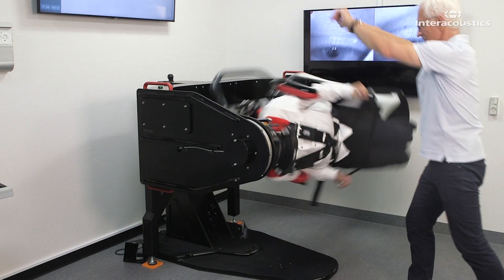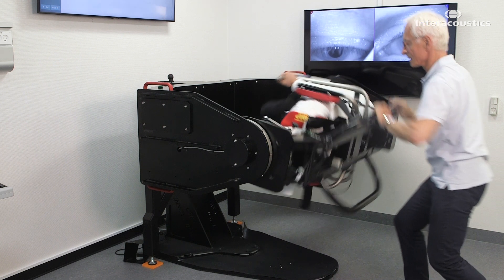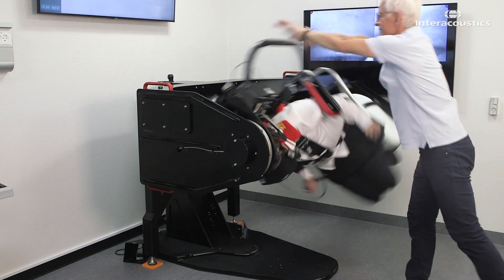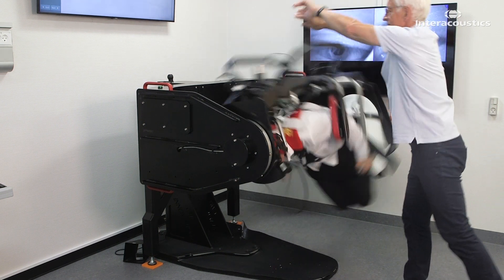When the first full rotation is complete, catch the approaching D-shaped handle to slow the rotation a little. Spin the secondary arm again in the same way until the patient has completed eight full turns over the healthy ear. After the eighth full turn, stop the movement abruptly.